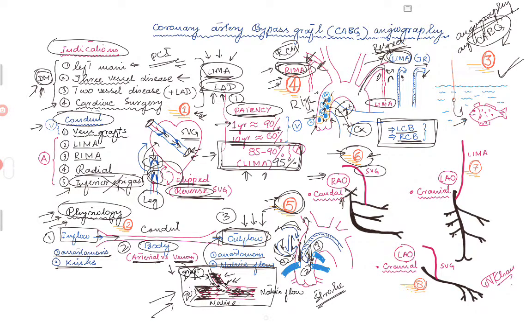And we have covered this in the previous angiographic talks. So basically what you want to do is ask your tech to move the camera to an angle where you know where the artery will be. So for example, in this, you ask the tech to move the camera to the RAO caudal view, and as we said, the caudal view is good for the circ. So you will see this artery here, and if the vein graft is filling this artery in the area where you think it should be, then you can say, okay, this graft is going to the left circumflex, or the OM in this case.